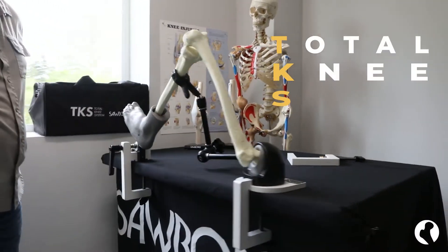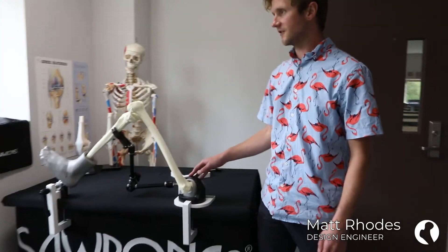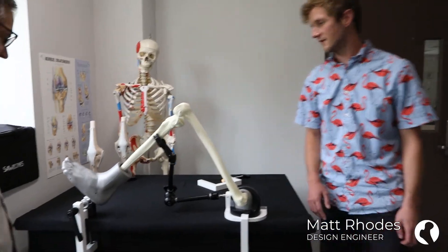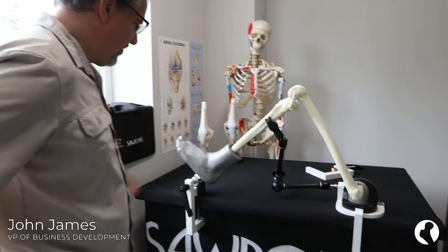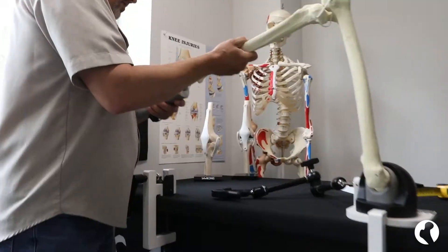The TKS, or Total Knee System, was designed for demonstrating and training total knee arthroplasty on medium or large knee bones. The TKS is portable, easy to use, and can be set up in one minute.